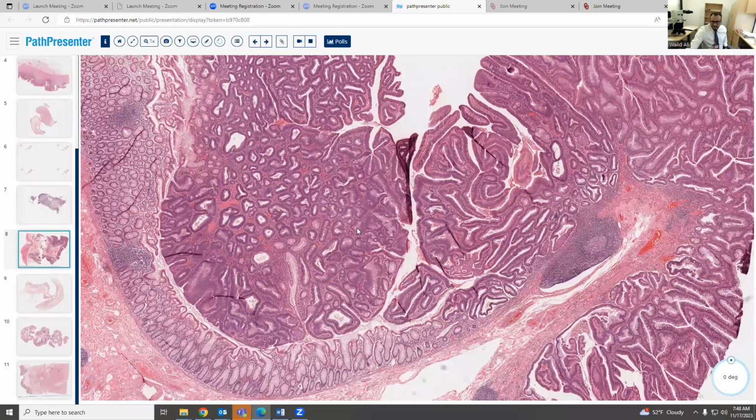They say if you see a lot of villous component, like 80%, you call it villous. But there's also subjectivity in this, especially if it's a biopsy, you might not see the whole polyp, so you're just going to go with tubulovillous adenoma. And tubulovillous adenoma is pre-cancer.